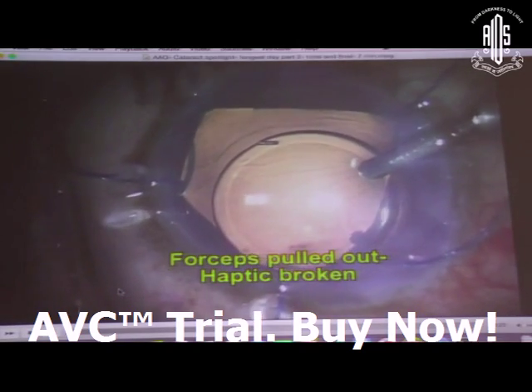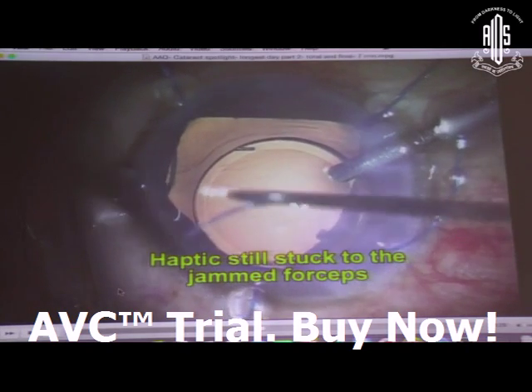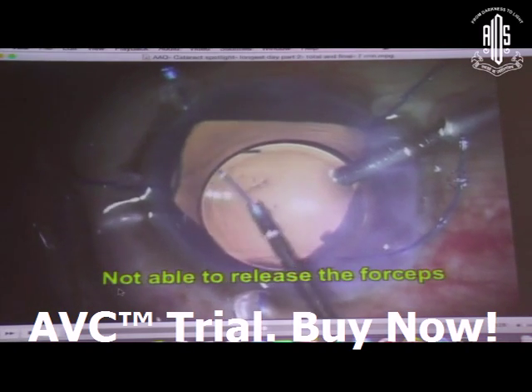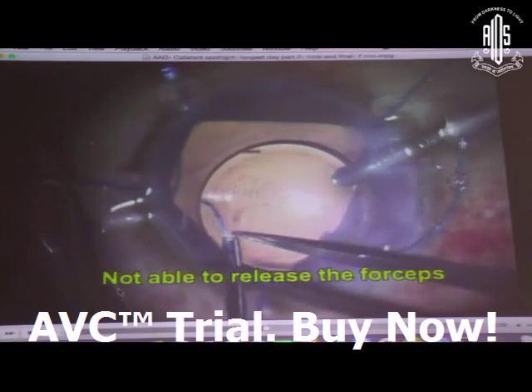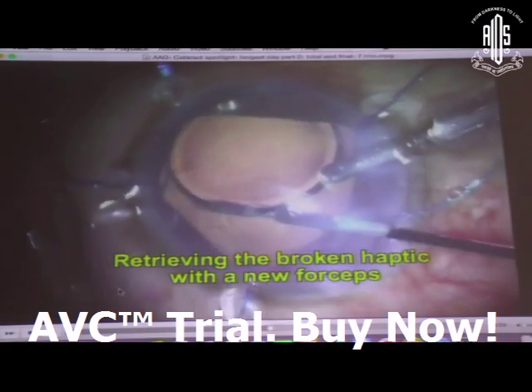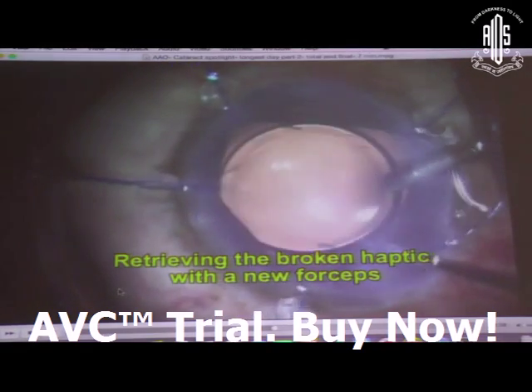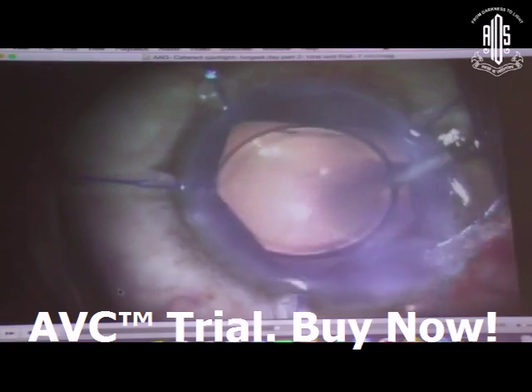Now you see, I decided I'll take a new forceps and look at that old forceps. I'm trying to release that haptic outside. I can't even separate it outside the eye, and like a fool I was trying this maneuver inside the eye. So I go in with a new forceps and I'm trying to catch that haptic, bring it out.